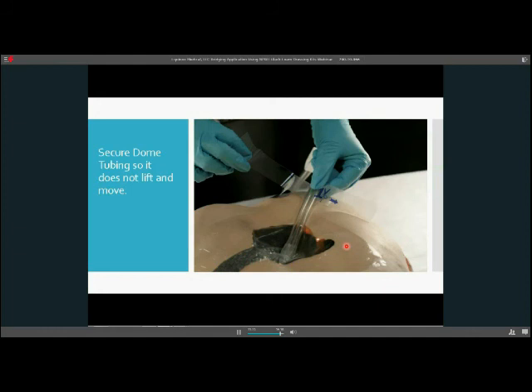I'm going to go back one and just show you. Another thing I've noticed in the last few things that I've gotten in the last few months, people want to keep their seal for 72 hours. So they get the idea, I'm going to take some more transparent and I'm going to recover this. It's not getting off, no way. And the problem again is that it impedes airflow.